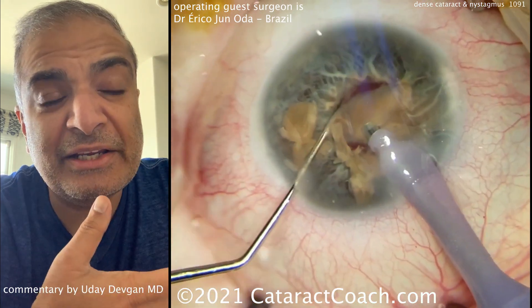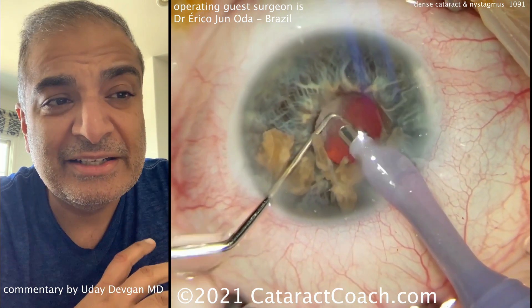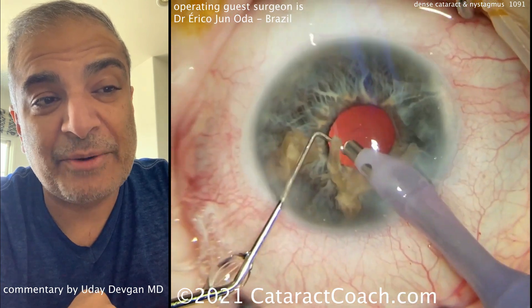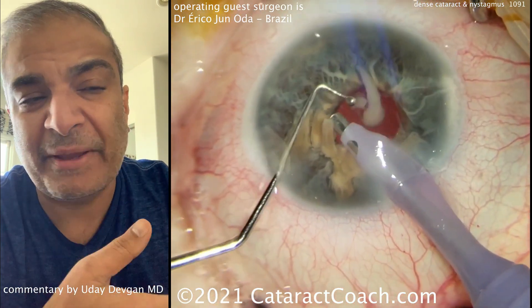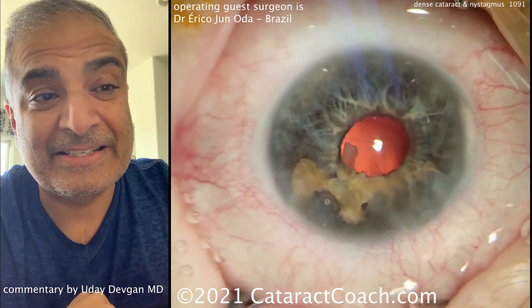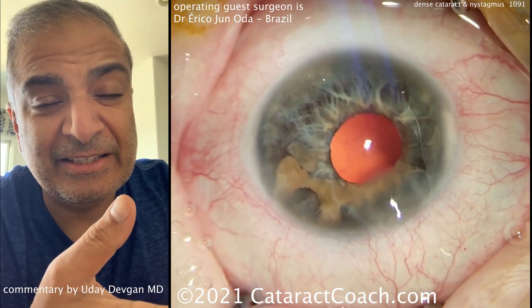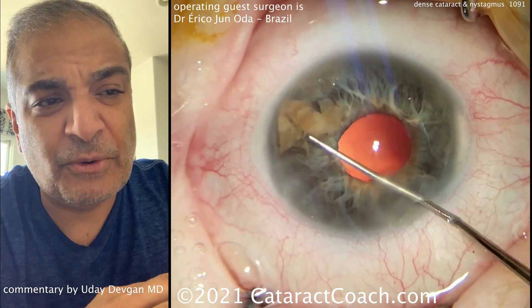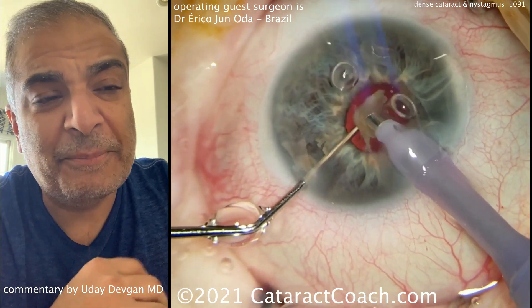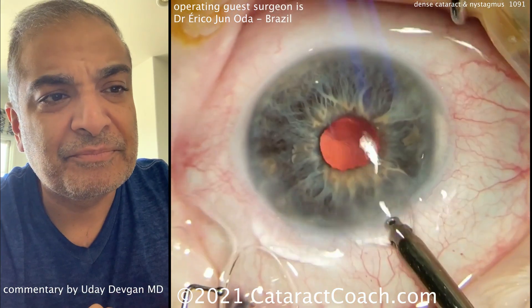If you are going to do general anesthesia for a patient like this — and I don't think you really need to — it may behoove you to do both cataracts the same day: bilateral sequential cataracts, treating each eye as a separate patient. That way the patient can undergo general anesthesia just once and get both eyes done at the same sitting. In a case like this, you're going to put a monofocal lens in — there's probably going to be foveal hypoplasia and limited best corrected visual acuity. I'd aim for plano or close to plano, maybe a little myopic, about half a diopter or so.